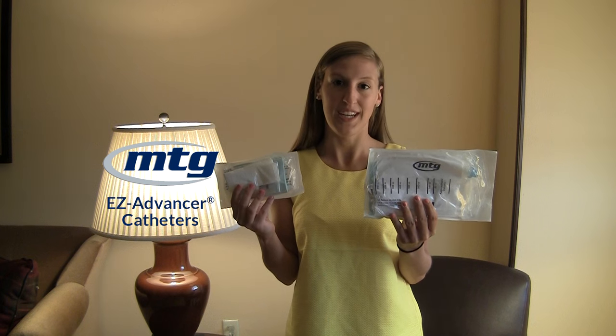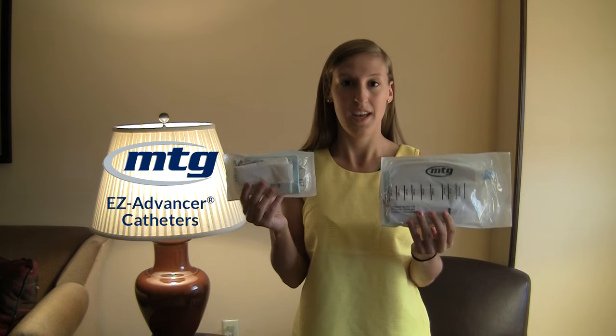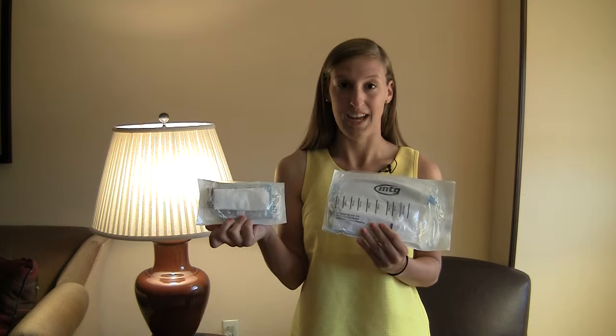We have the MTG Easy Advancer that comes in the regular size and also the mini size. Today for the demonstration I'm going to show you the regular size, and everything that's in the regular size also comes in the mini size.